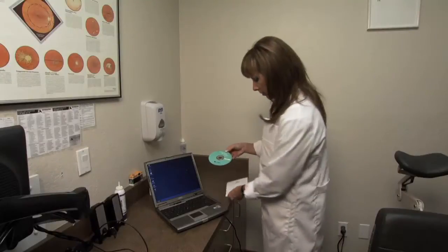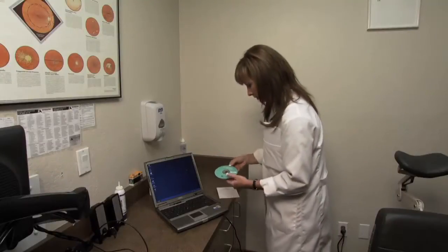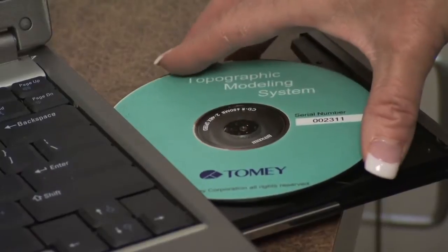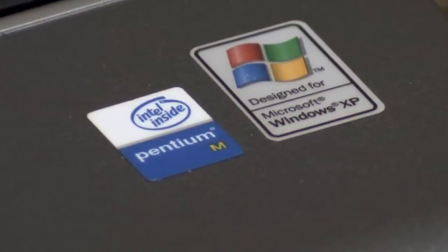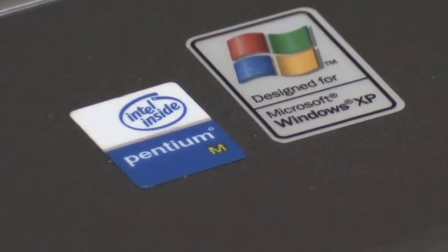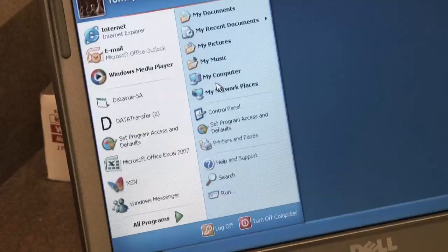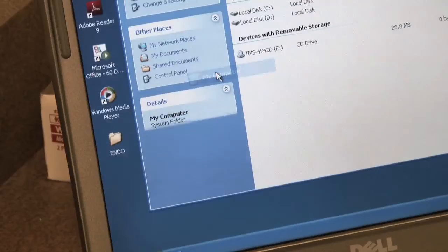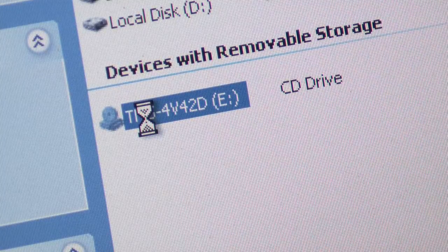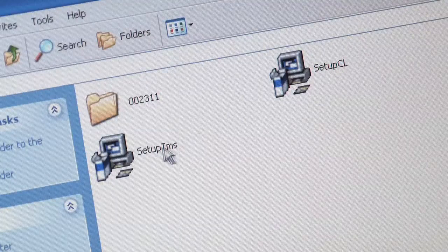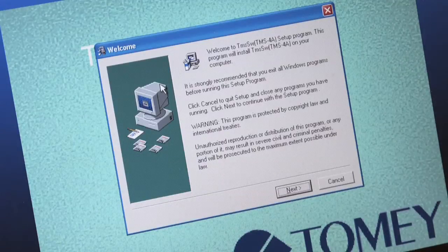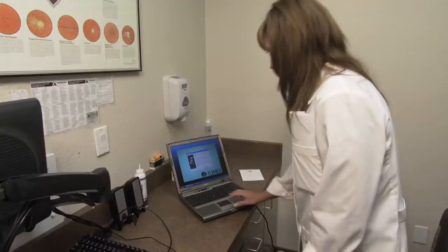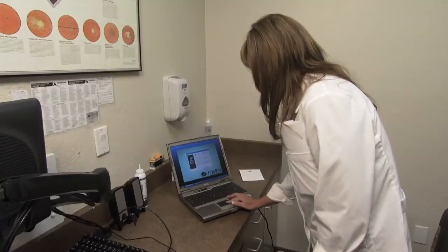Insert the TMS4 software CD into the computer. Microsoft 2000 or Microsoft XP is recommended for this device. Click Start and then click My Computer. Double-click the CD-ROM. Double-click Setup TMS. A welcome icon will display a warning and recommend that you exit. Ignore this warning and left-click Next.